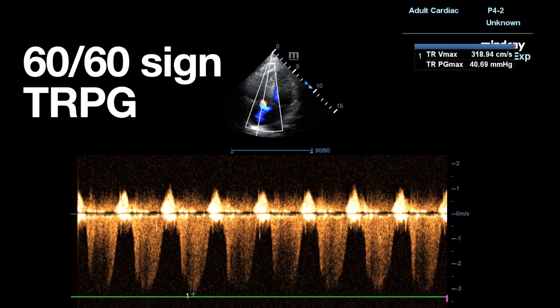If there is a sudden increase in the TRPG over 36 mmHg but less than 60 mmHg, this can be more reasonably attributed to an acute insult such as a large acute PE. If TRPG is over 60 mmHg, it can be theorized there is a chronic process at play, allowing the RV to accommodate such elevated pressures through slow hypertrophy.